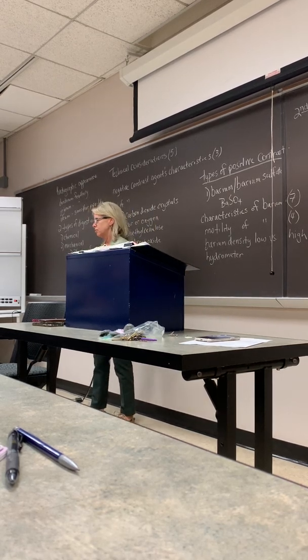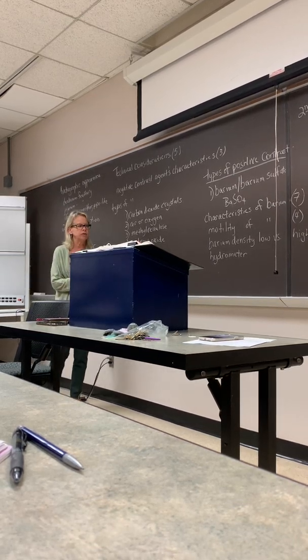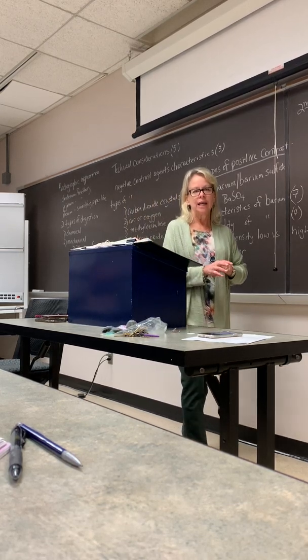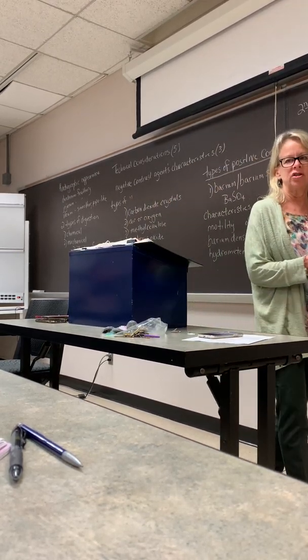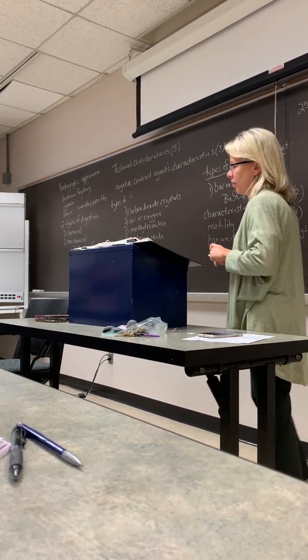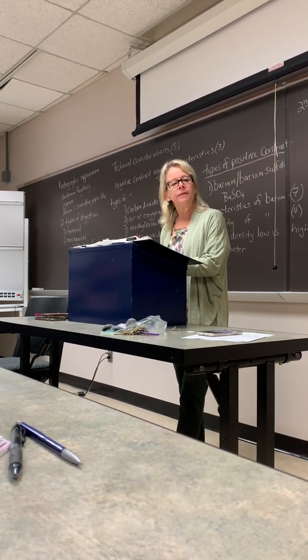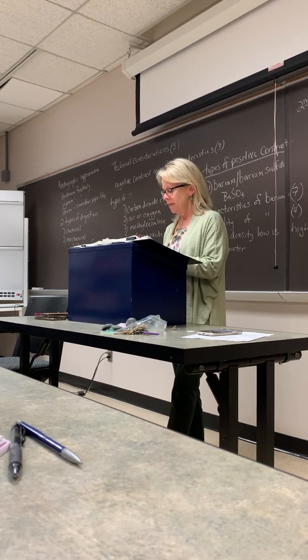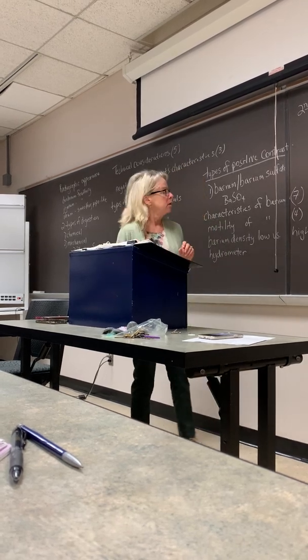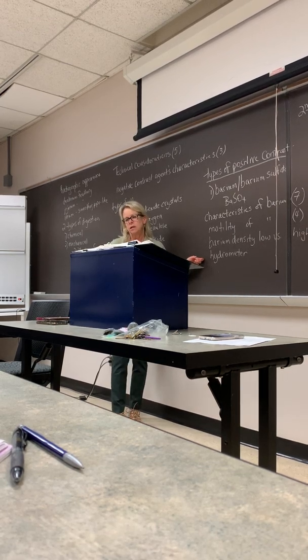There's barium that's considered low density. You can see through it a little bit better. It's thinner. And there's HD, or high density barium. It's just thicker. It's whiter on an image. Thinner means you can see through it better. The thicker it is, the more white it looks. You call it low density versus high density.